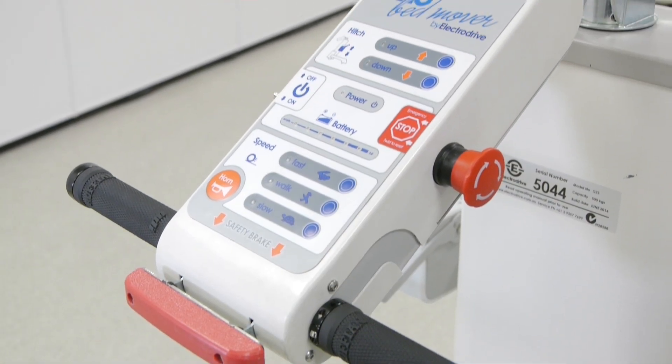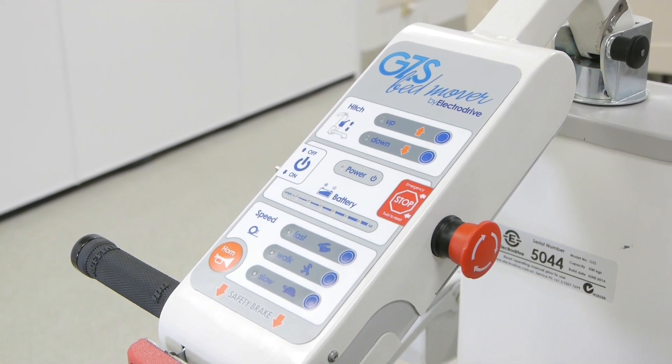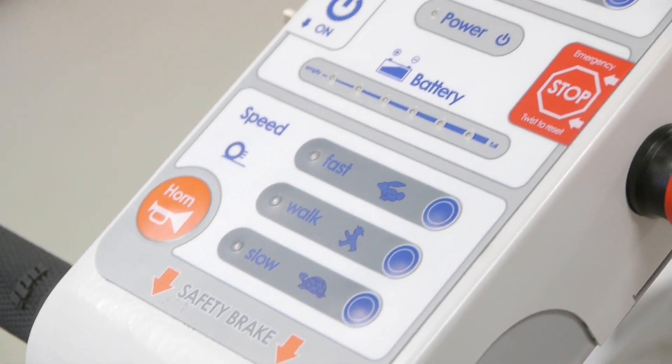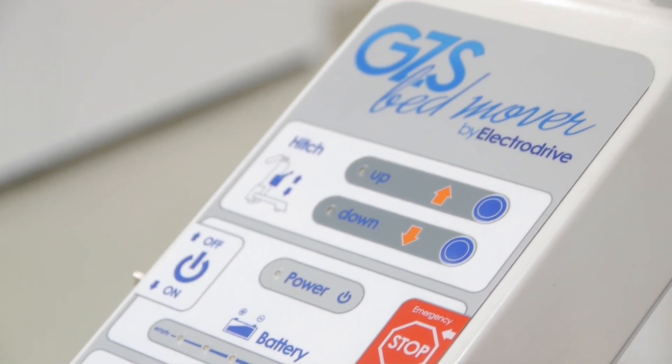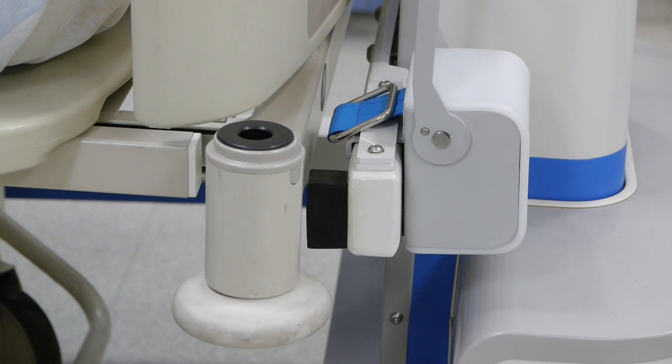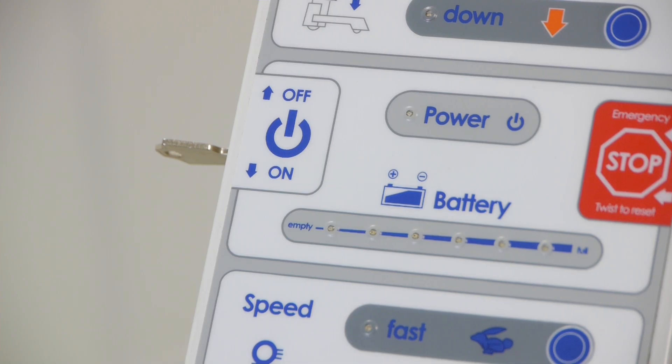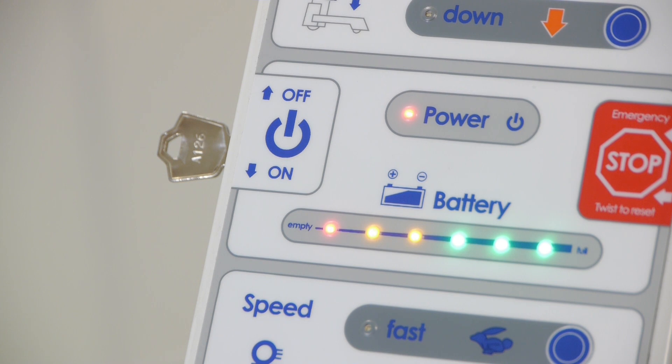Everything you need to operate the Gezunda can be found on the control panel. From here, you can select your speed, check battery power levels, or electrically adjust the height of the hitch bar for easy connection to the bed. It is also from here that we turn the Gezunda on and off using the key switch.